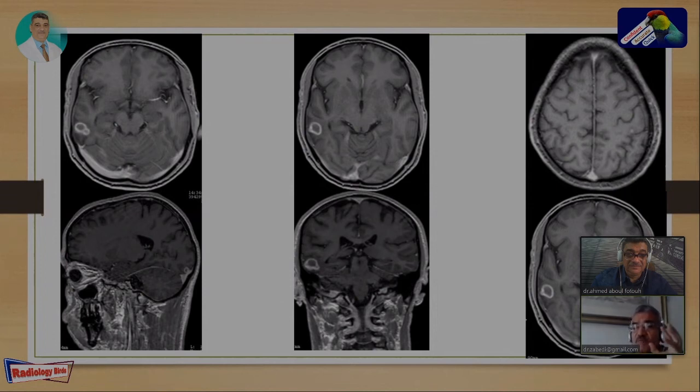Anyway, we put in our differential diagnosis an inflammatory partially calcified granuloma. And I put in my mind tuberculosis, brain TB, because I have done more than one study, some of them published on TB, brain TB, central nervous system TB. And they told me, of course, it can be something else. I said, yes, of course, any other inflammatory process, but TB is with irregularity of the border. This is one of the most important features. Thick wall, irregularity of the border, no specific mass effect, calcification, whereas pyogenic abscess is well defined, regular, and the edema is much more.